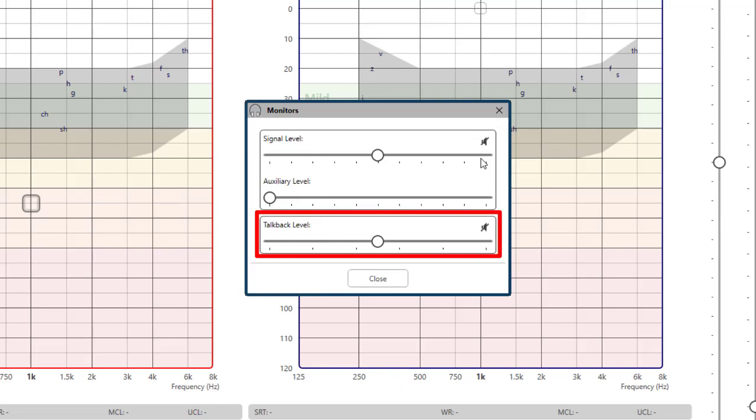The talk back level controls the volume in your headset when listening to the patient. Again, this can be enabled or disabled.